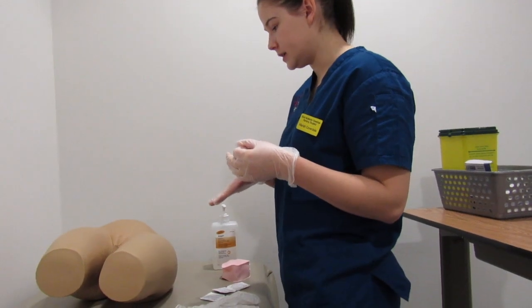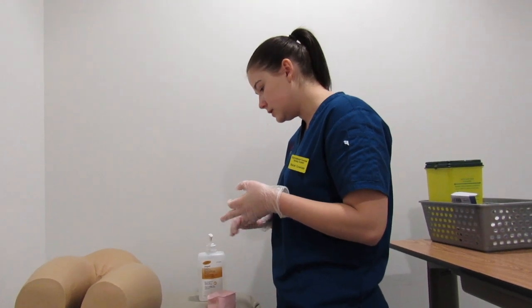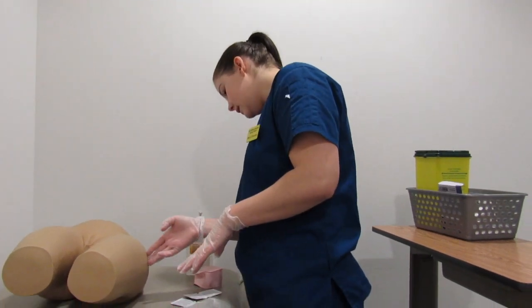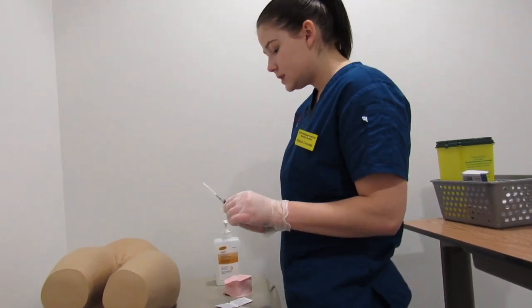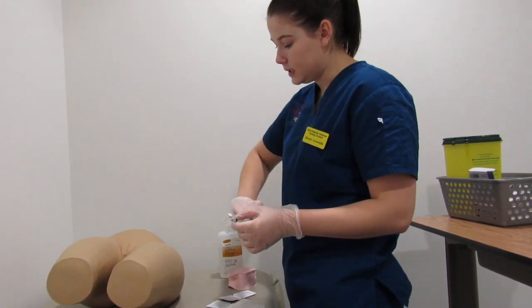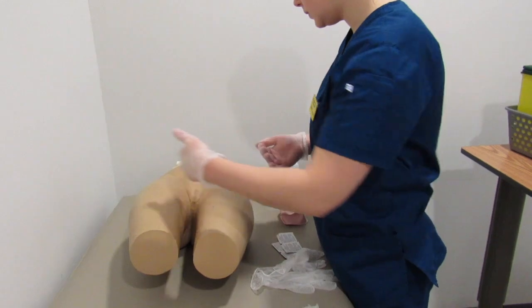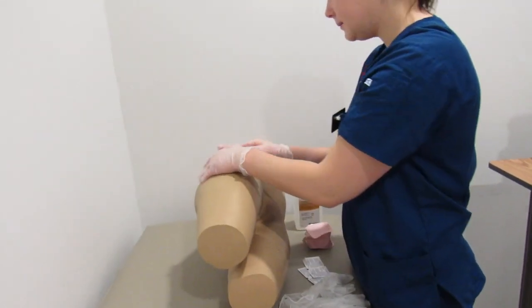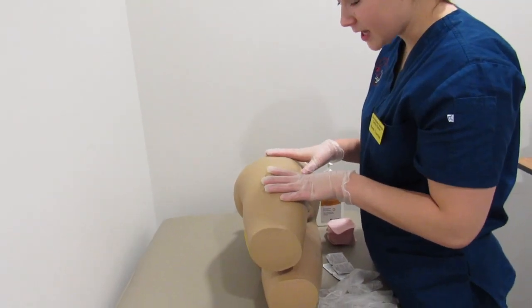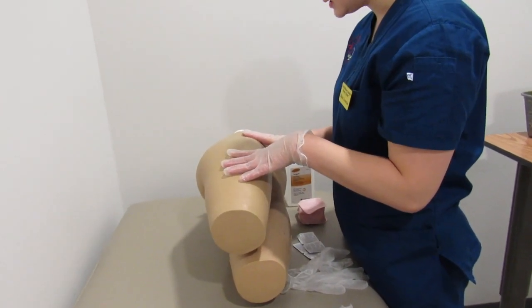So before I begin the intramuscular injection, I'm just going to assess the patient for any muscle atrophy, reduced blood flow, and any circulatory shock. I'm not noticing any issues right now with the patient. And just one other thing to note, with an intramuscular injection, the needle is going to be longer because I'm injecting it into the muscle. Okay, now Mr. Mancini, I'm just going to get you to roll towards me. And I'm just going to assess the area again for any reduced blood flow, muscle atrophy, or circulatory shock around the area that I'll be injecting the site.